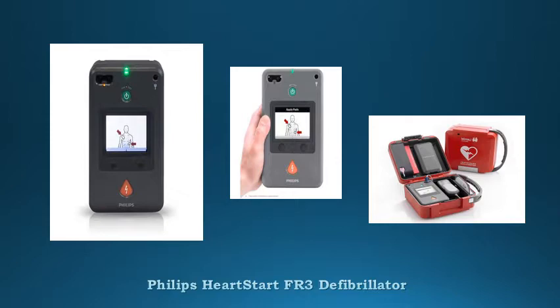Bright high-resolution color LCD screen makes the FR3 easier to use in a noisy environment. Daily, weekly, and monthly automated self-test including PEDS integrity.